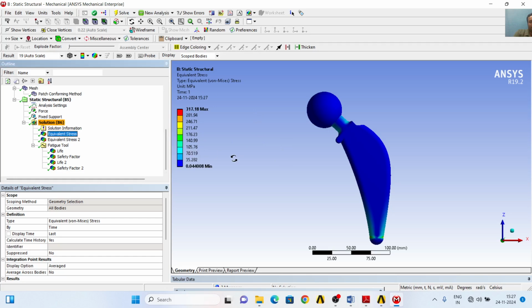And now you can see that the equivalent stresses for the whole body, all bodies, have a maximum of 317.18 megapascal of stresses, which is far below the limit. And where is it taking place, the maximum equivalent stresses here, and minimum is in the head. Okay, so the maximum equivalent stress is taking place at the bottom of the geometry and the minimum is taking place at the head geometry.